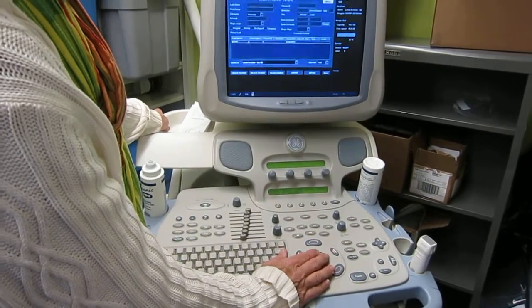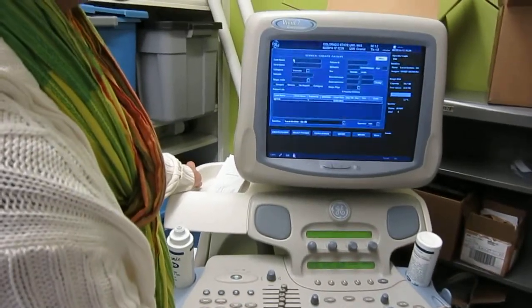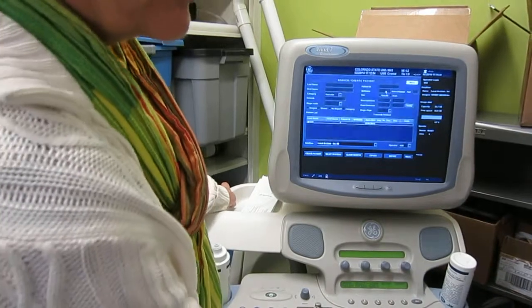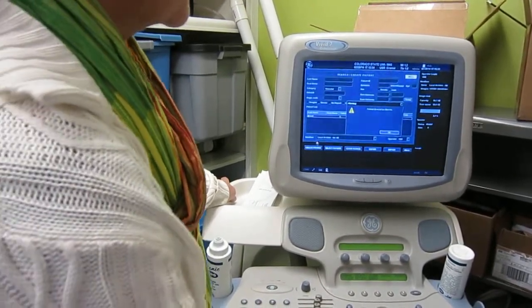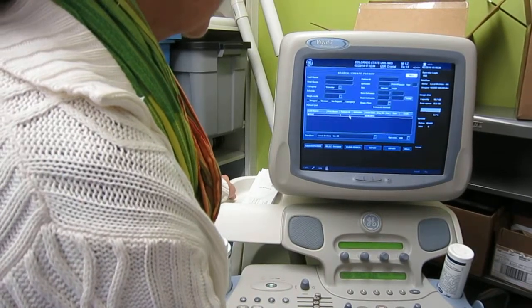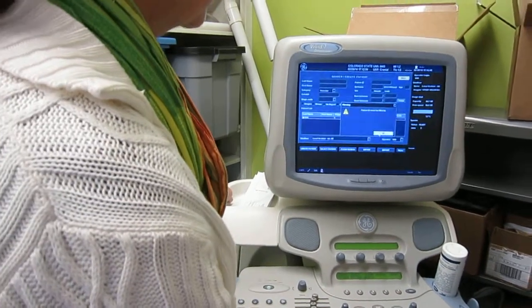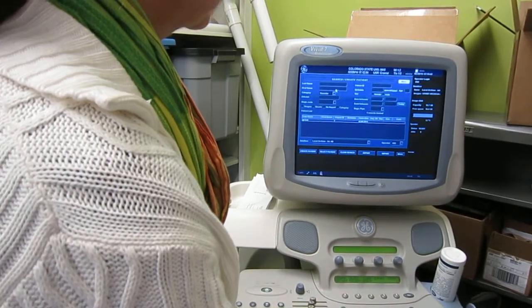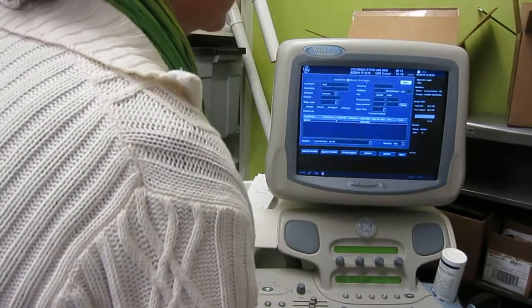All right, so we put that information in and it actually stored that as I changed the data flow. So here it is, and we're going to say create that patient. Normally it would still be up here if we hadn't changed the data flow, but you're going to create that patient. Highlight this and create that patient. All right, and we'll do it again. Test.